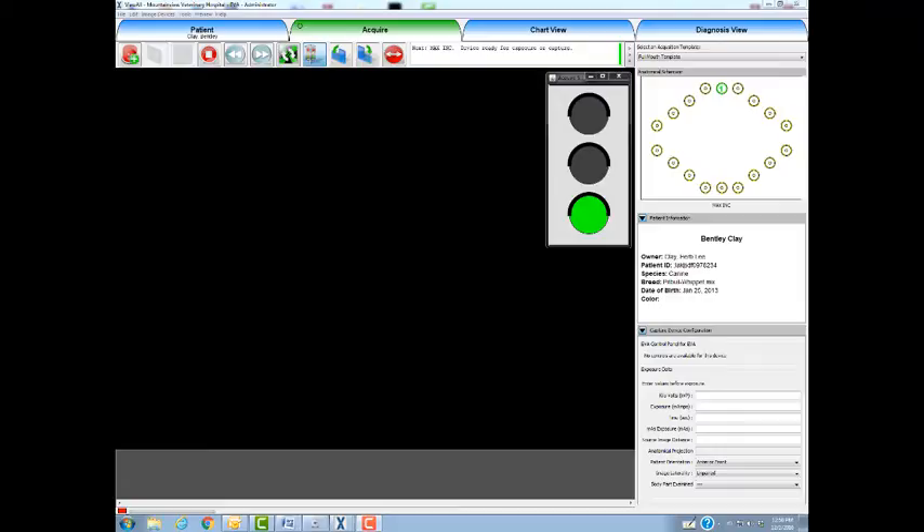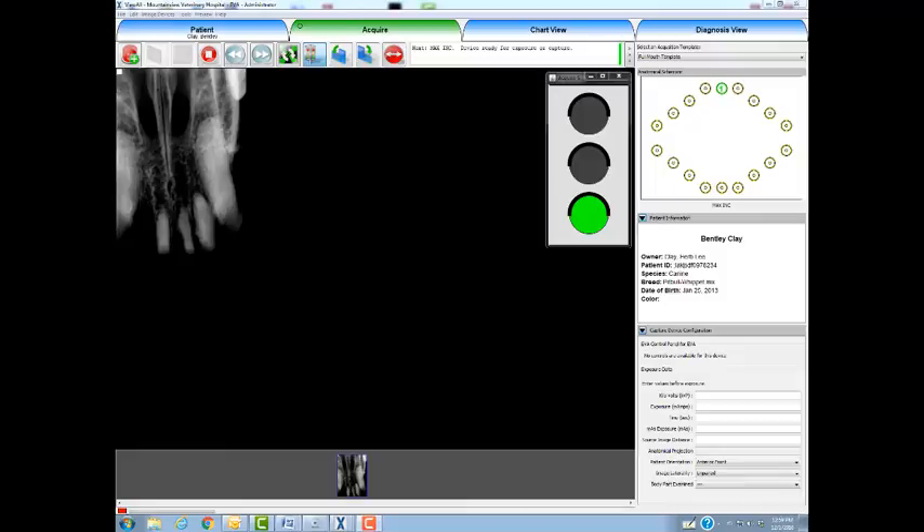Now we are looking at the acquire screen from within the ViewAll software. The green stoplight indicates that the software is ready to accept an exposure. After the exposure, the light turns yellow for approximately five seconds, after which the radiograph appears and the light turns green for the next exposure.